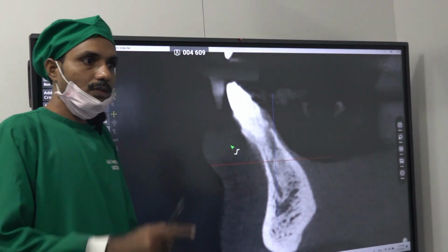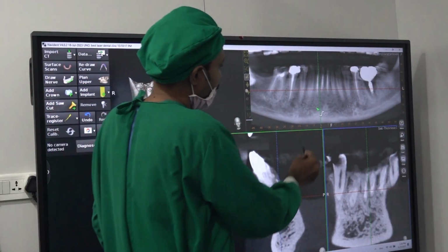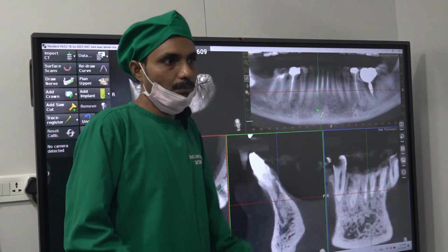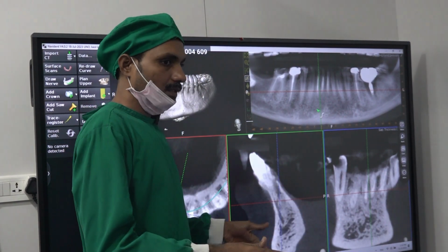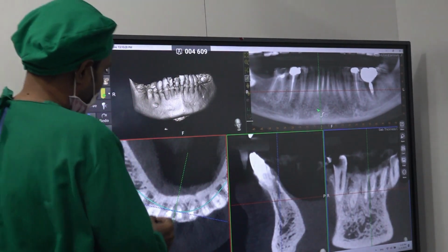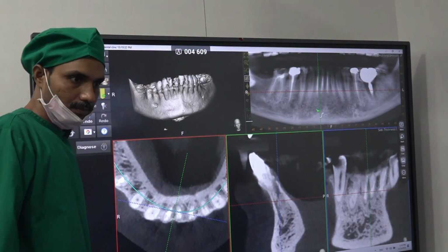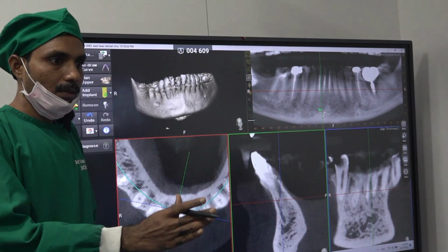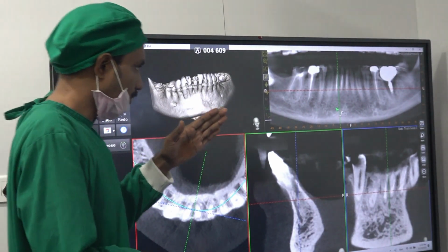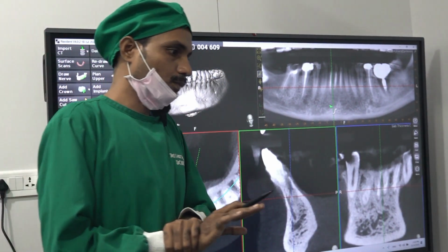So that inside bony vessel is in the midline. That is why avoid placing an implant exactly in the midline, because you may injure the vessel inside the bone. So place the implant in the lateral incisor. And avoid perforating from premolar to premolar lingually. These are the 2 rules. Don't place an implant in the midline. Don't perforate lingually from premolar to premolar or canine to canine.